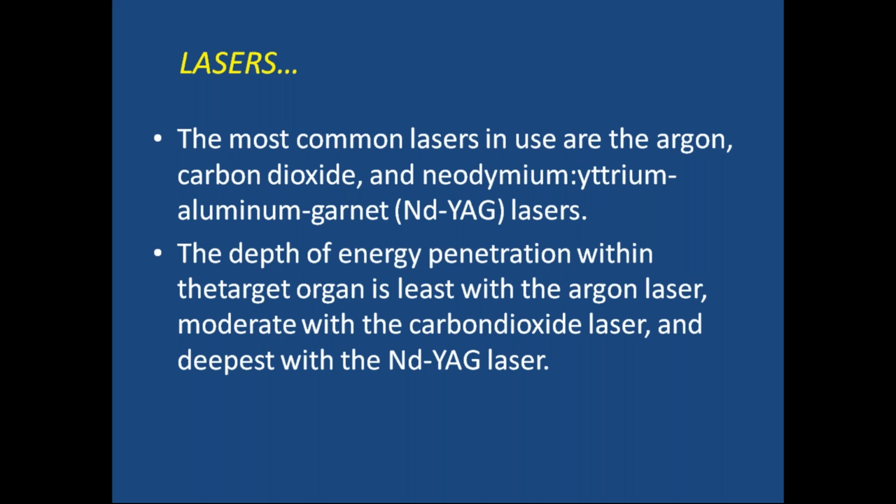The most common lasers are argon, carbon dioxide, and Nd:YAG, that is neodymium, yttrium, aluminium, garnet lasers. The depth of energy penetration within the target is least with the argon laser, moderate with carbon dioxide, and deepest with Nd:YAG. So we prefer Nd:YAG in case of deep tissue or a larger amount of tissue required for resection.